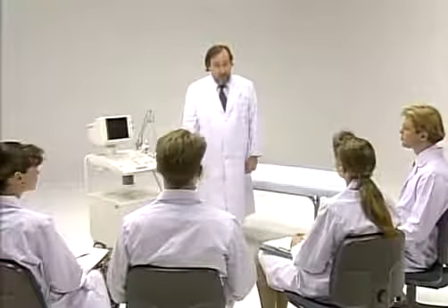Now we start an ultrasound examination. But, Christine, are there any precautions we must note? Well, since we want to obtain clear images, we have to ask the patient not to eat before the examination. The stomach should be empty. That's right. Then if the patient did eat, what would happen to the images?